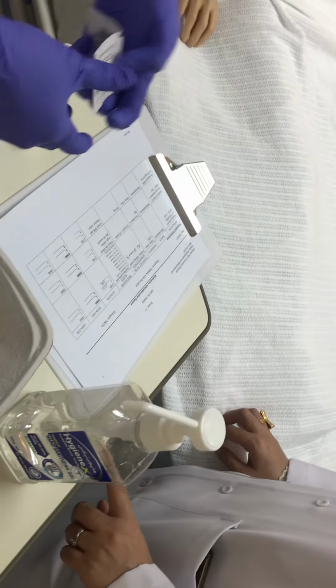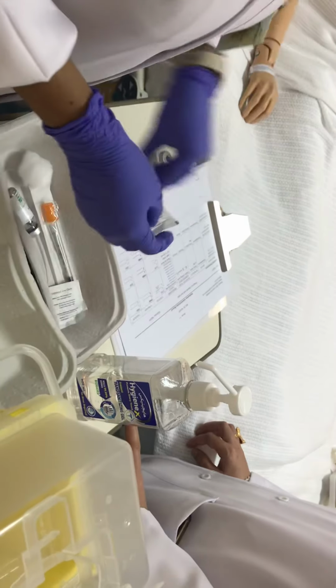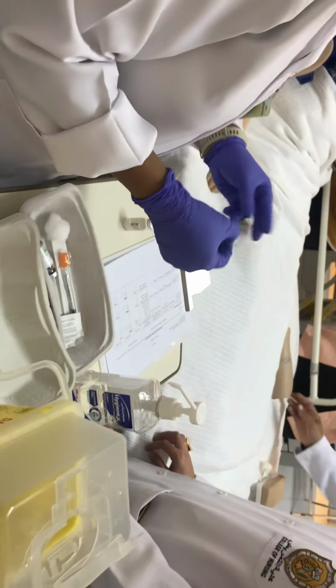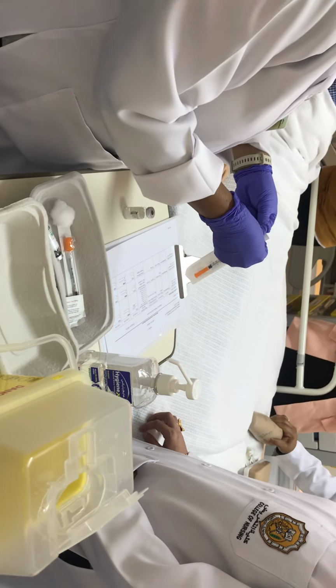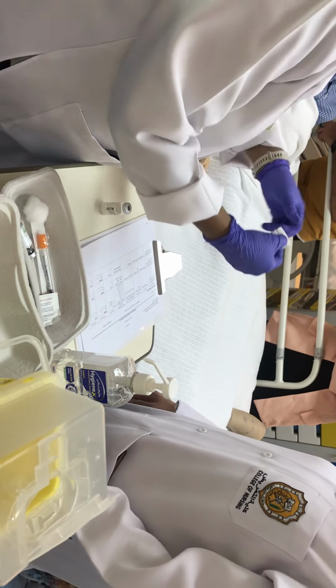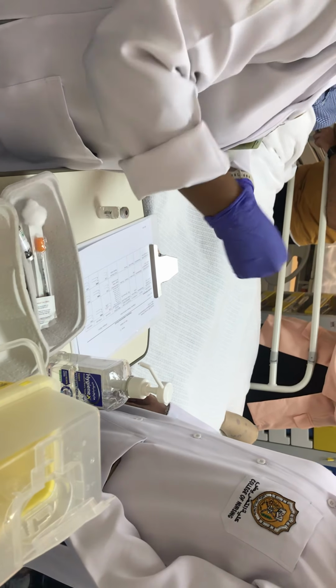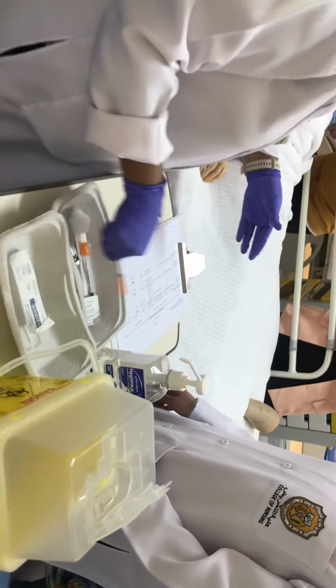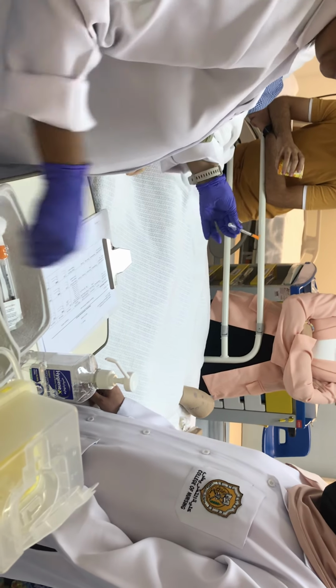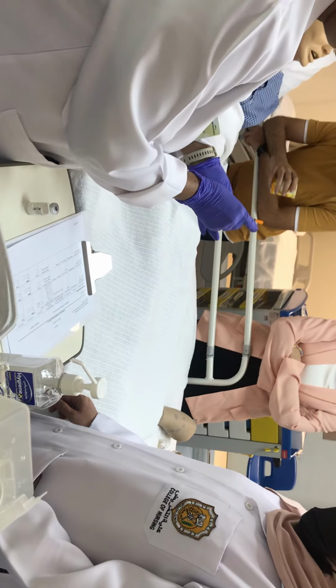After the second check, I'm just keeping things ready. Okay, you see what all I'm keeping ready. You can even open this and check the expiry date. When you are collecting also you can check, or you check it here. Okay, it's not expired. If it is open, we can keep it down also, nothing will happen till you open others. Why do we ask them to open? Some syringes may be stuck.